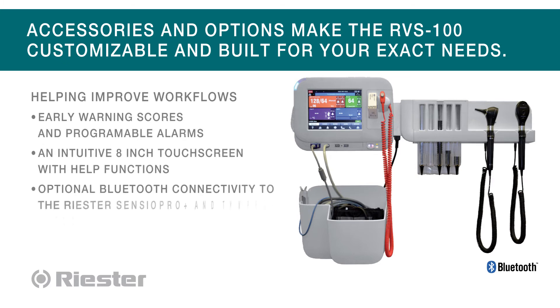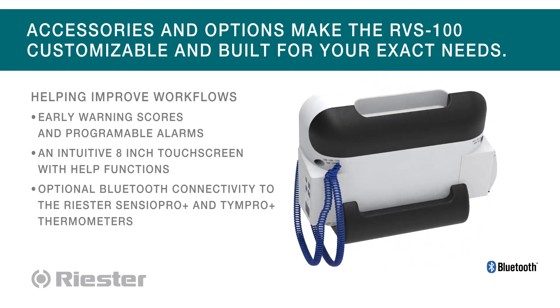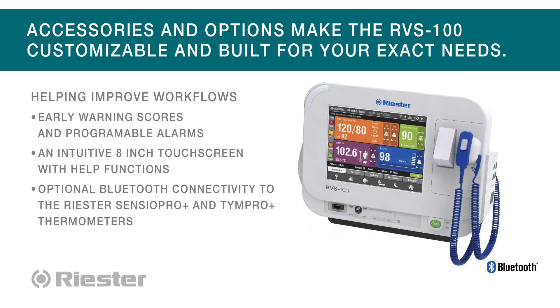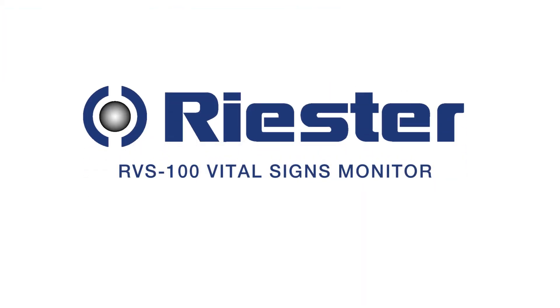Early warning scores and programmable alarms, an intuitive 8-inch touchscreen with help functions, and optional Bluetooth connectivity to the Riester Sensio Pro Plus and TimPro Plus thermometers. The Riester RVS100: a fully customizable vital signs monitoring system.